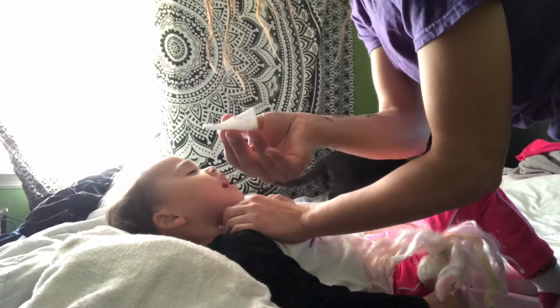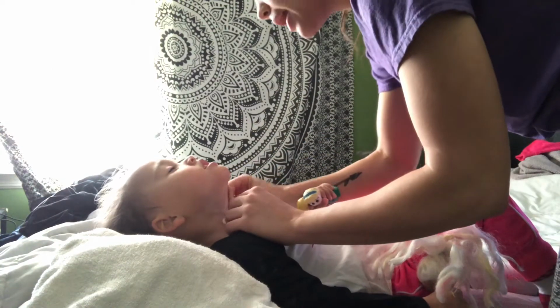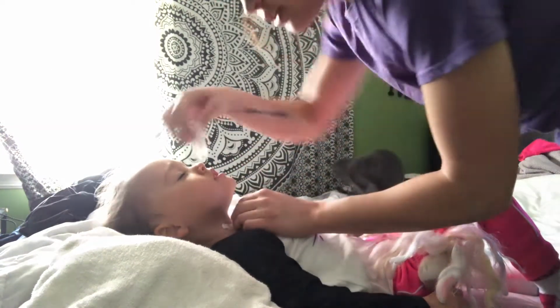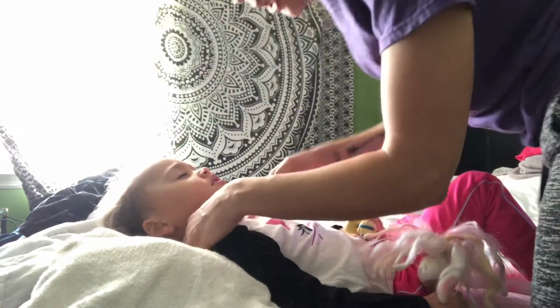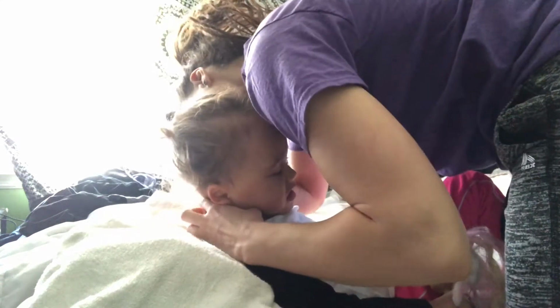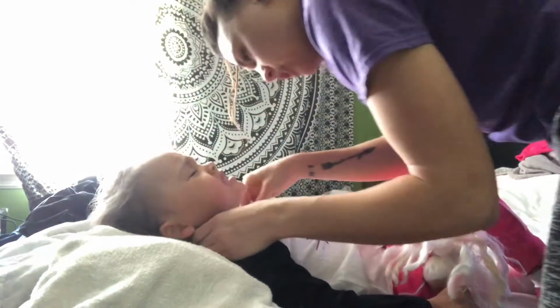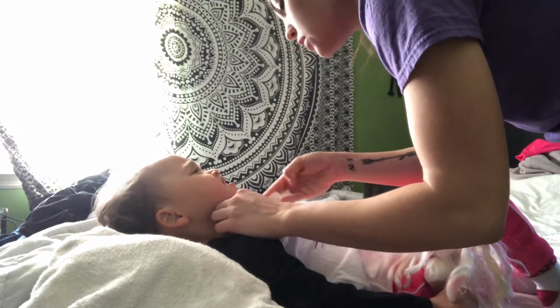And then here is the wet one. Hold on, baby, stop. You're going to look up to the sky, up, up, up. I'm just going to wipe around her neck to clean it, while I'm holding the trache in place. You really want to clean it really well. I mean, we change it almost daily, so it doesn't hurt. Come on, look up.